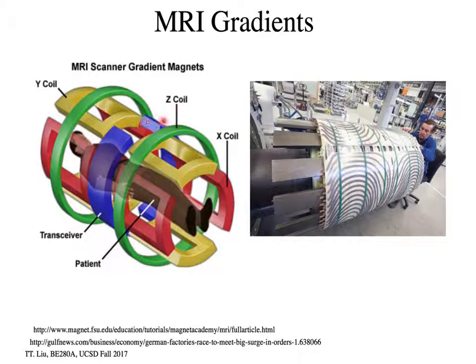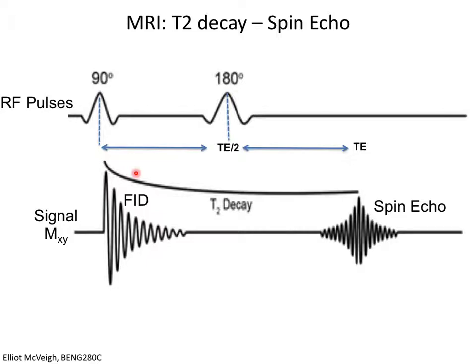Again, the geometry of the gradient coils, we looked at how the Z coil functions and how the X and the Y gradient coils function, and recall that the business end of those coils are the current paths that are very close to the imaging volume. The imaging volume in a magnetic resonance imaging system is approximately spherical, and the diameter of that sphere is probably about 35 to 40 centimeters. It is the volume over which you can make an image with reasonable resolution and signal to noise, which is fine for imaging the heart.